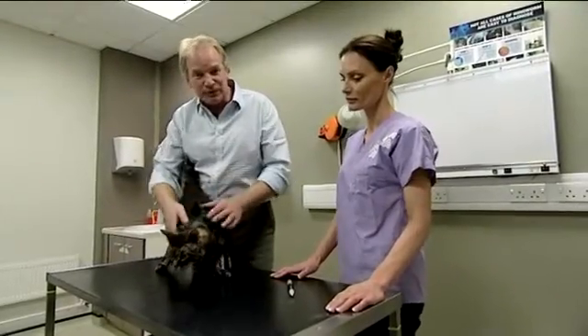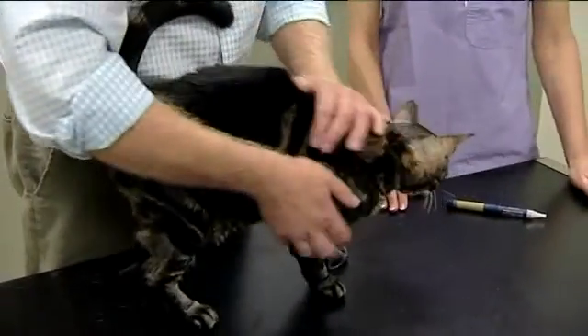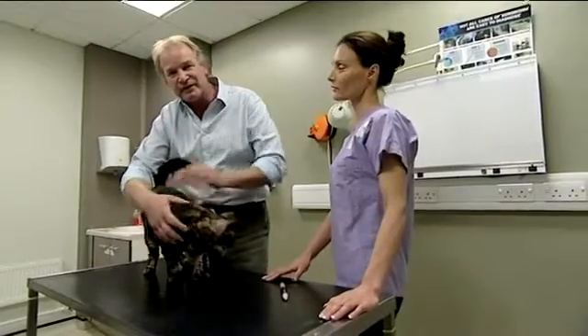So I'm here with Wilf, a typical diabetic cat. He's pretty large. Wilf has been diabetic for about six months, and to maintain his health, he's been having regular injections.